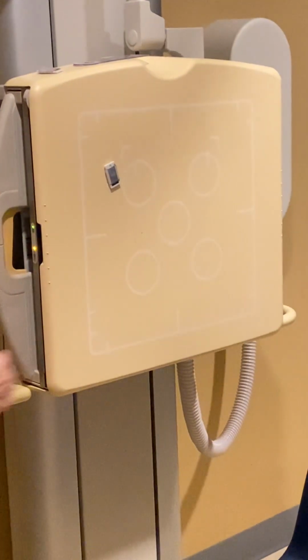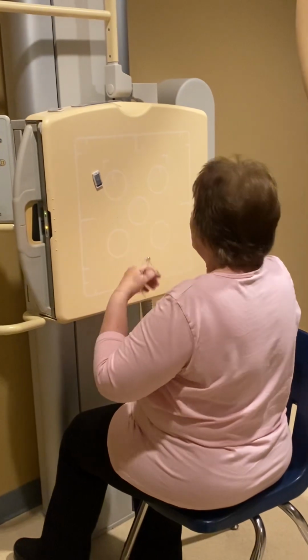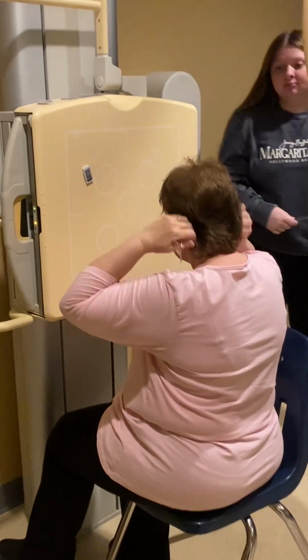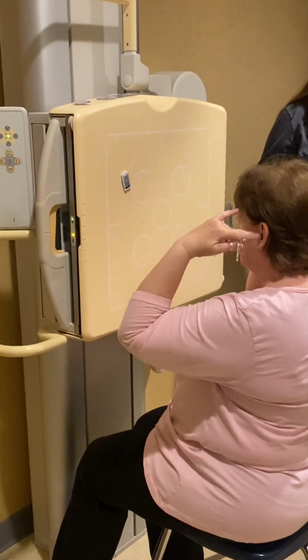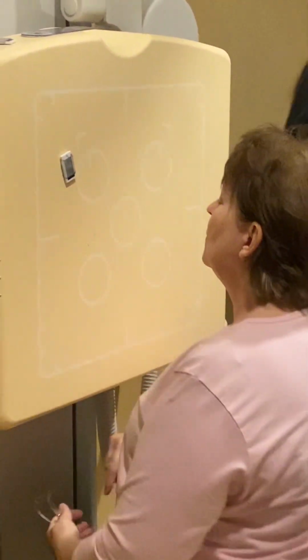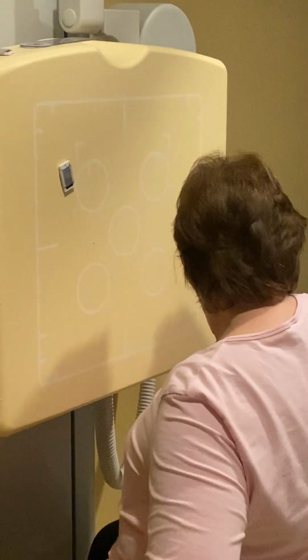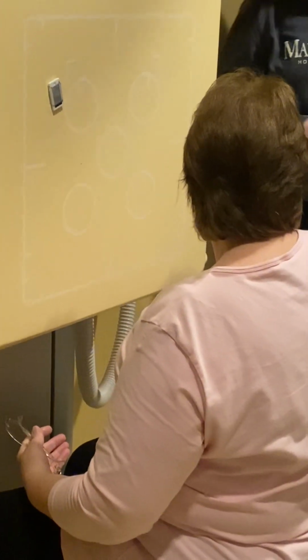All right. So I need 2 people to be over here and 2 people to be over here. And what I want you to do is to look at the head. You know, to just look at the head here. So let's just say we're going to do the PA Axial Caldwell. And I'm going to keep my body back here. And Thomas, get over this way more.